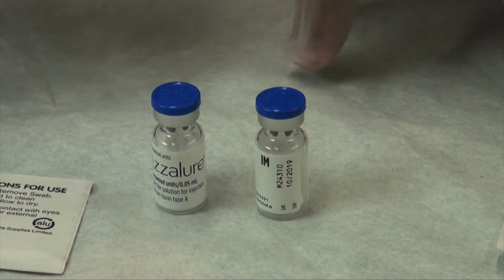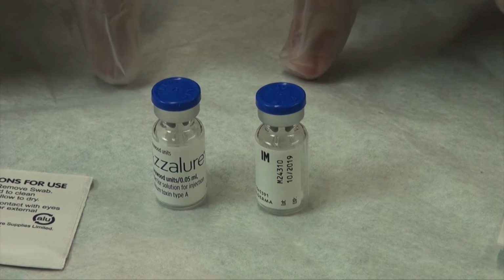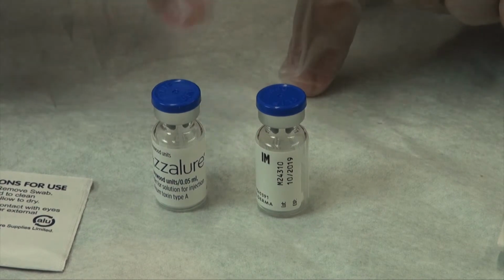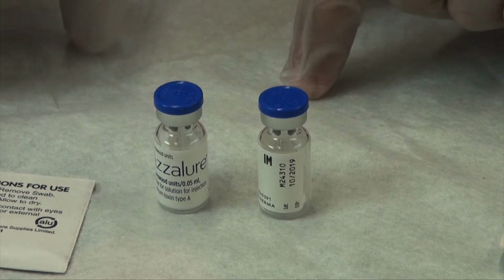The total amount, therefore, here is 250 Speywood units of toxin. 250 Speywood units of toxin is equivalent to 100 units of Botox or 100 units of Bocouture.